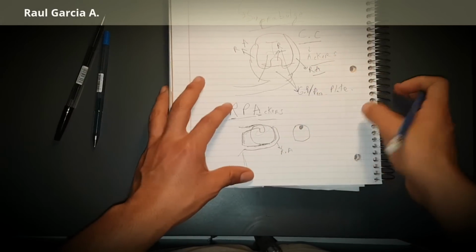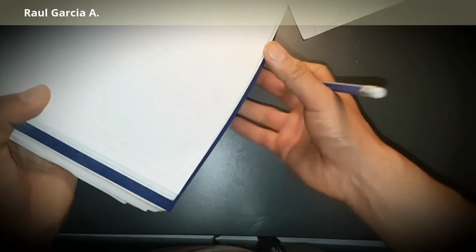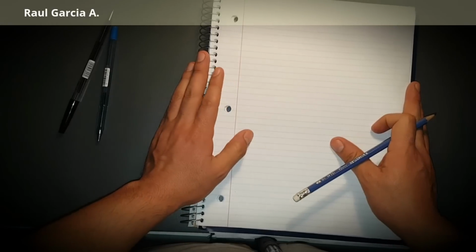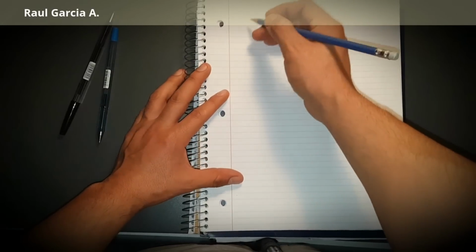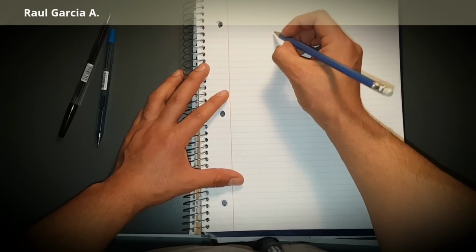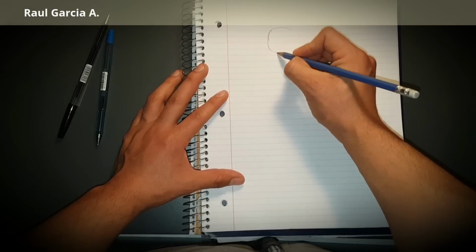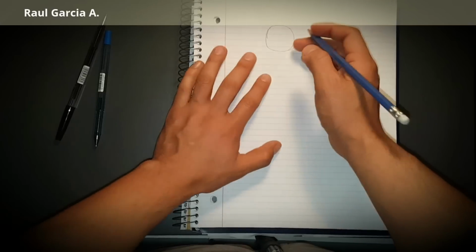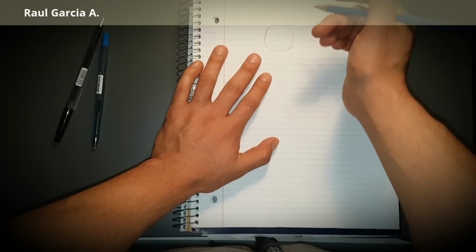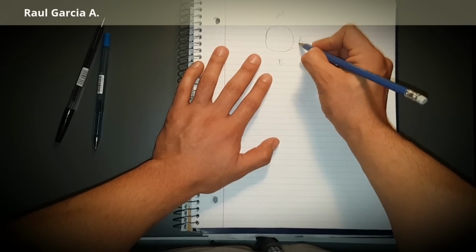Now, let's see another suprabulge. Then I'm going to make the difference between the infrabulge clasps. So another common suprabulge one is the back action. Let's draw here a premolar. Sorry for my drawings. Okay, let's say that's a premolar. So your back action comes, say this is the mesial, the distal, the buccal, the lingual.